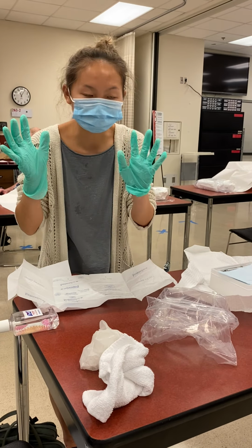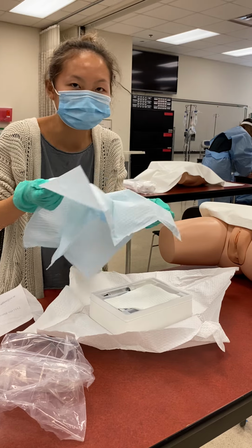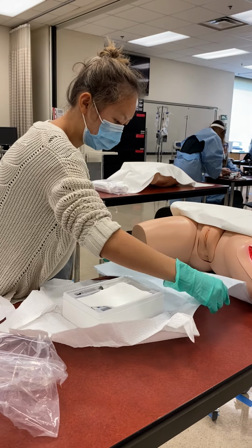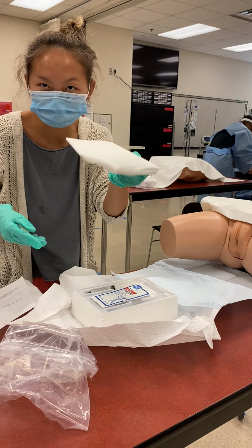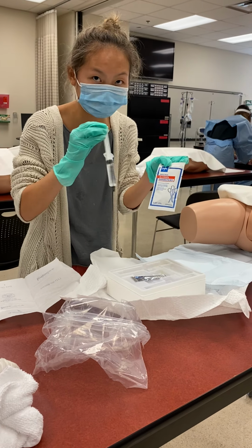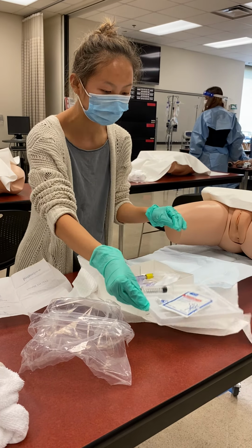All right, I have my sterile gloves on, and so now we have this peri pad, so we want to put this underneath our patient just in case there's any fluids or vaginal fluids that come out while we're doing the procedure. So we're going to put this underneath our patient before we begin, and we can throw this off to the side so we won't be using this. And so we have our alcohol swabs and our 10 milliliter syringe and our lubricant, so we can put this portion off to the side for right now over here.